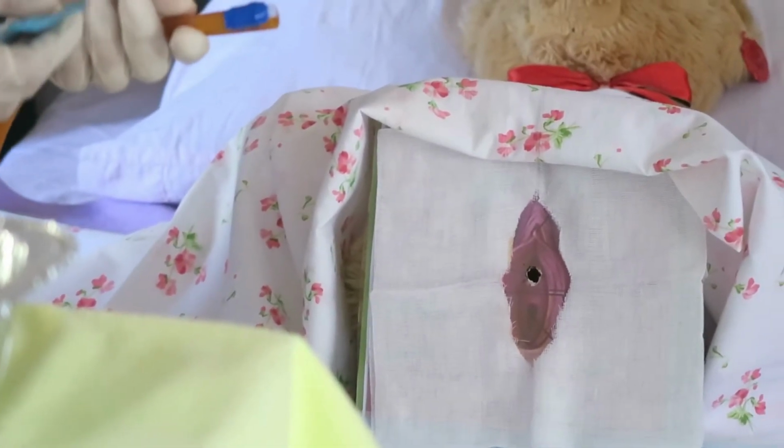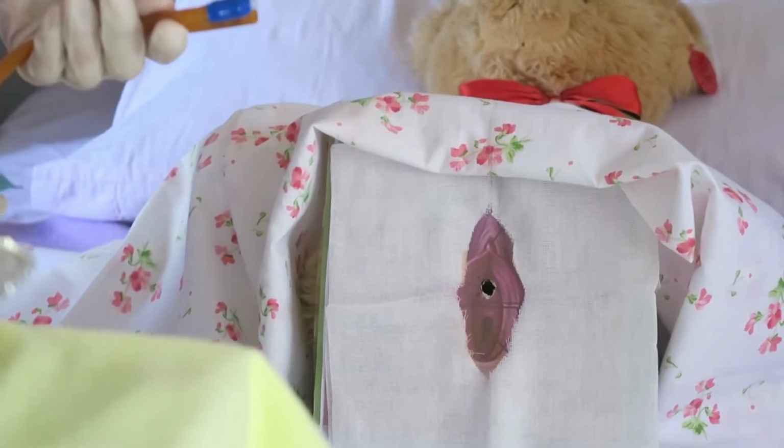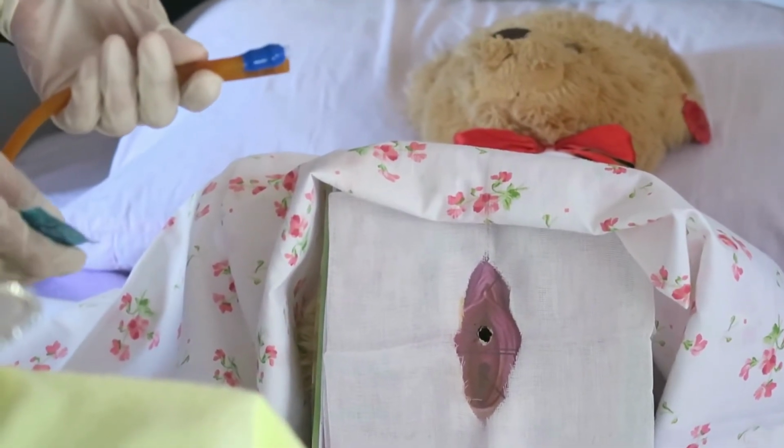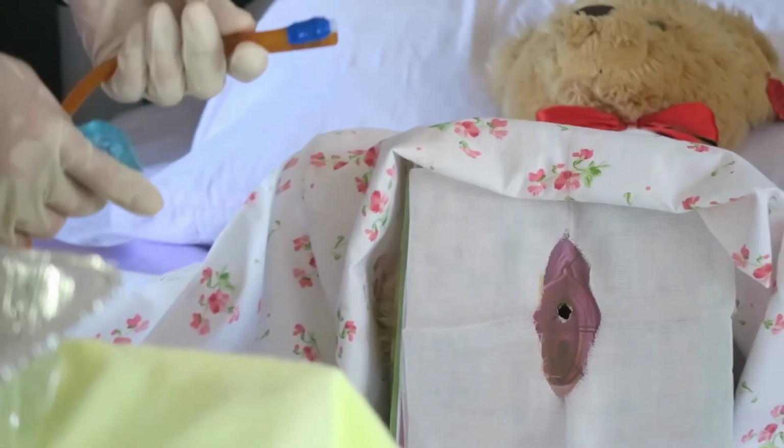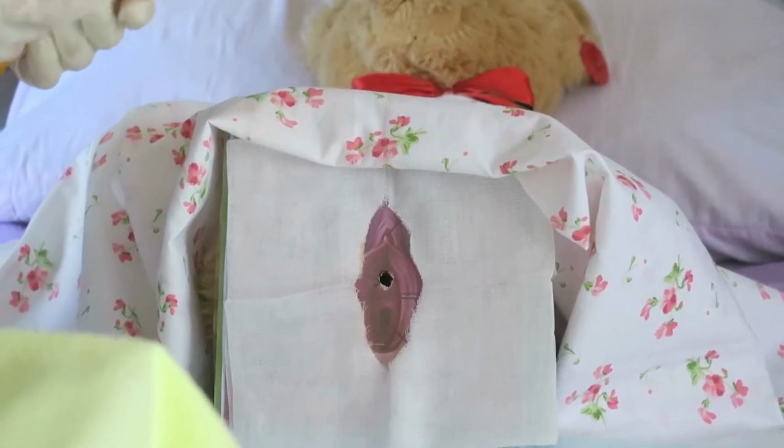Place the thumb and 1 finger of the left or right hand between the labia minora. Separate and pull up gently. So this is to provide good visualization of the urinary meatus. So I will put the lubricant gel.